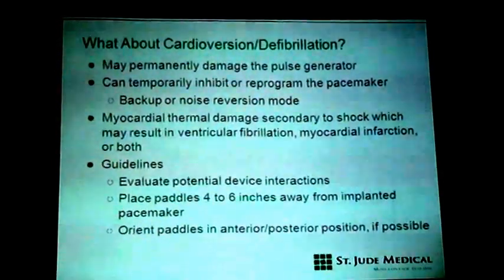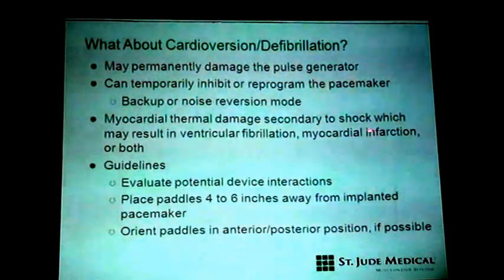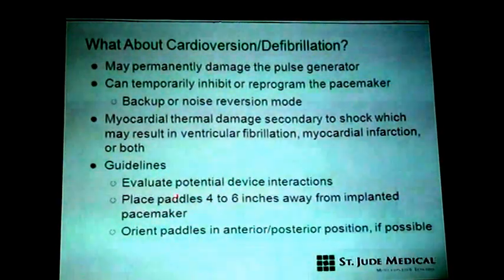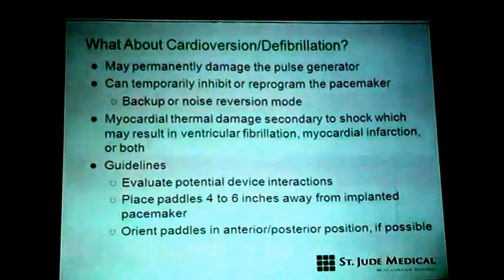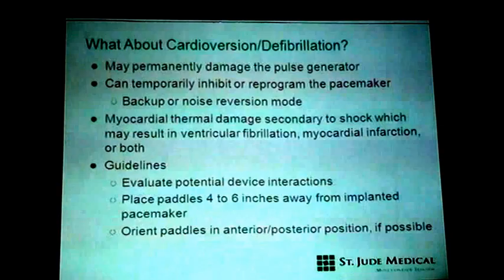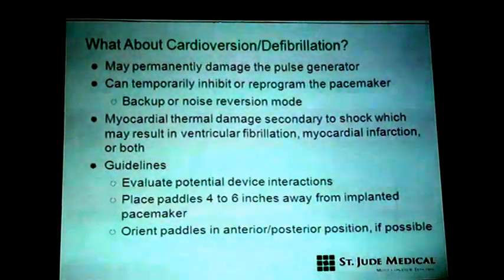First, the defibrillator: if you put it like this, it may damage the device. So we have to decide on the basis of life threat. If life is threatened, the paddle should be 4 to 6 inches away from the implanted pacemaker. Suppose a pacemaker patient has a sudden arrest and you want to do CPR and defibrillation. We have to defibrillate them, but our paddle should be as far as practically possible from the pacing site. If it is on the right, try to keep them as far away as possible.